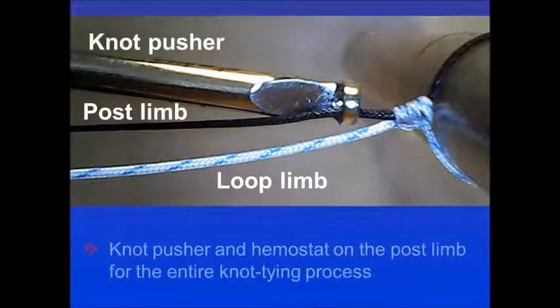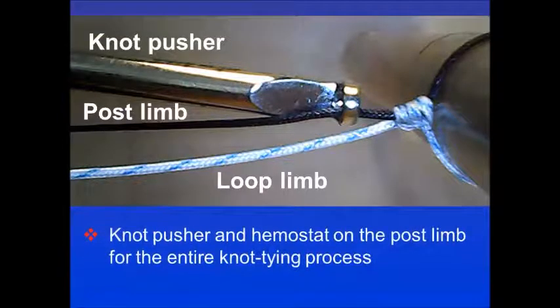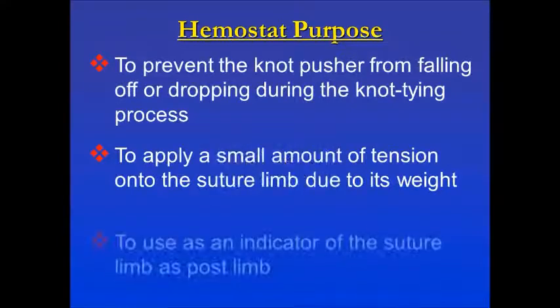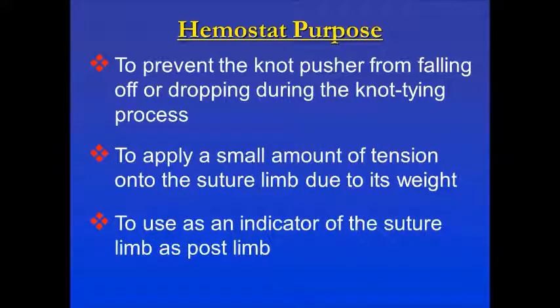This knot employs a standard knot pusher using a post limb and a loop limb. The knot pusher is kept on the post limb throughout the procedure, and a hemostat is placed on the base behind the knot pusher. The hemostat prevents the knot pusher from falling off during the knot tying process, applies a small amount of tension onto the suture limb due to its weight, and also serves as an indicator of the post limb.